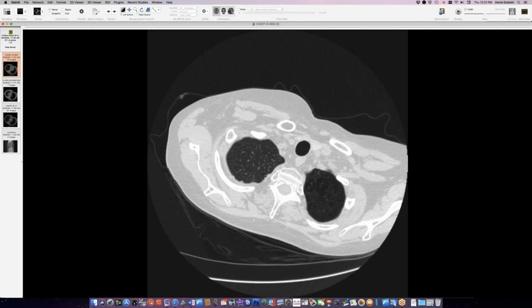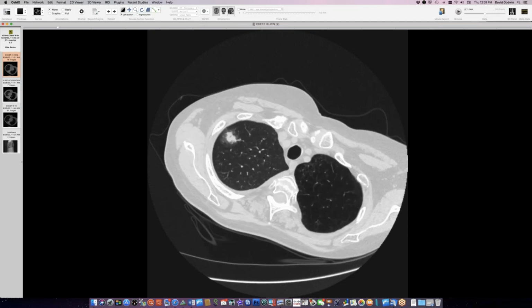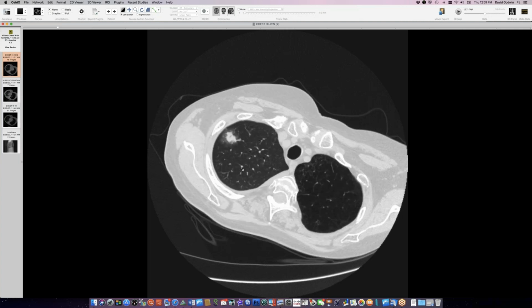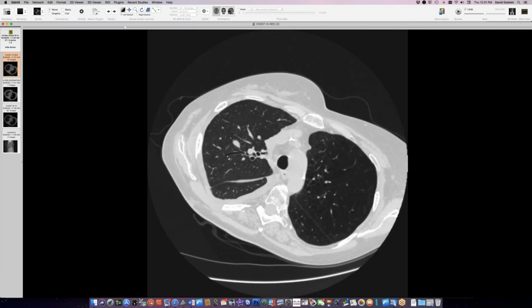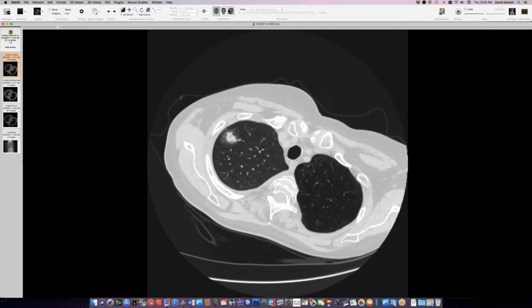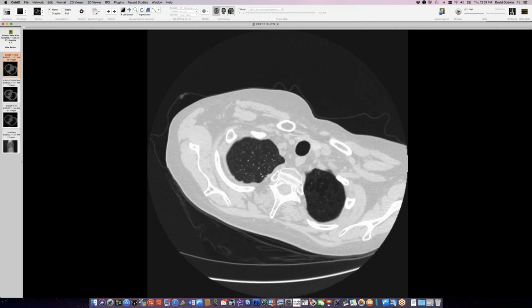So continuing the theme of lung transplantation, I want to show you guys this case of a person who had a single lung transplant in the setting of emphysema. So the native left lung is emphysematous, and the transplanted right lung has much better texture to it, actually has elastic tissue in it. And we do have this ill-defined nodule with a nice halo sign around it. So presumption on this thing would probably be first a fungal infection, an indolent aspergillus, or in this part of the world, sometimes cryptococcus would be considerations, nocardia, and PTLD would all be considerations.